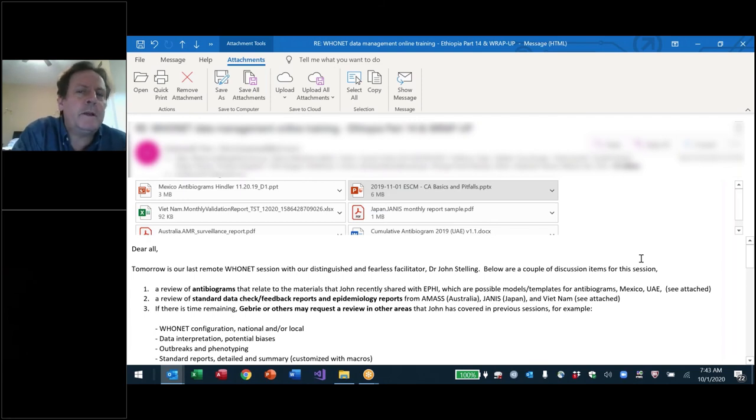The problem with this clinical approach, two problems with this clinical approach, is it takes a lot of time and effort and information that's not easily available. If you want to do this for everybody, every positive blood culture in the hospital, you need to look at the medical records for every patient with a positive blood culture and spend maybe half an hour or an hour on the patient's history and say, I see that this patient was hospitalized last week. I see that this patient had a surgery 3 weeks ago. I see that this patient was in a nursing home. I see that this patient was simply at home and they came in with pneumonia. So you can do that and say this is a true hospital infection or a true community infection.